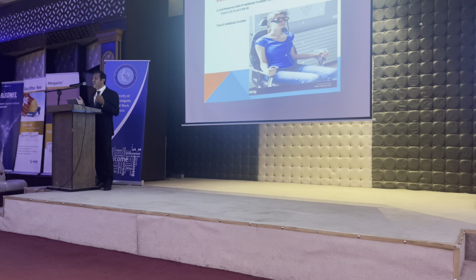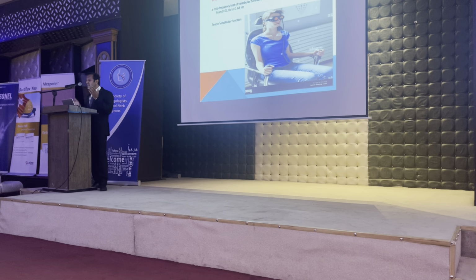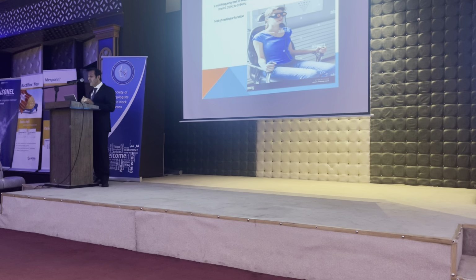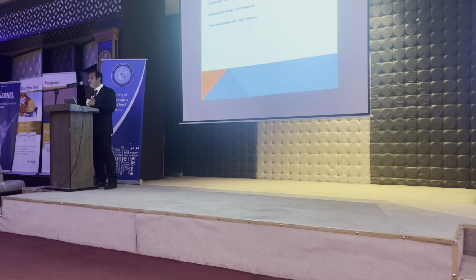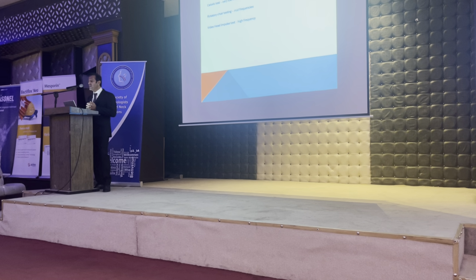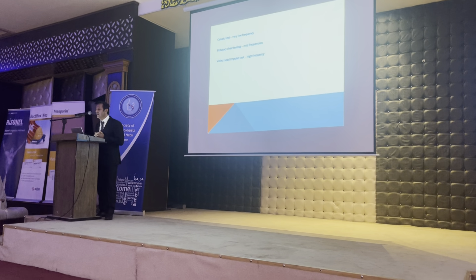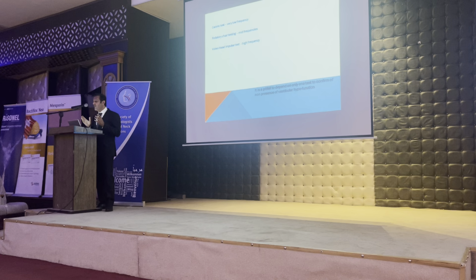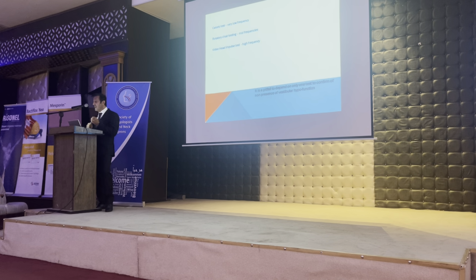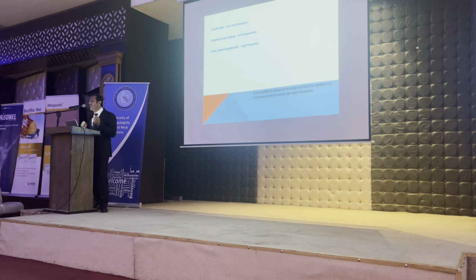Rotatory chair is also a test for vestibular testing, but it is in the mid frequencies. Dr. Firas also mentioned caloric is very low frequency, rotatory chair mid frequency, and the video head impulse test is very high frequency. So that's the point. It is a pitfall. It is a pitfall to depend on one test to confirm the non-presence of vestibular hypofunction.